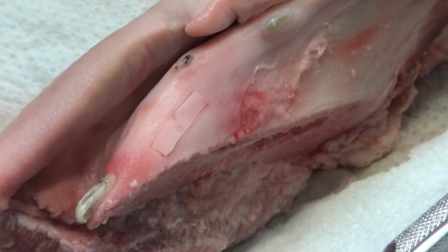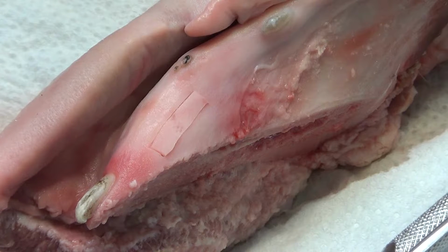The most important thing is to try to maintain the same thickness from the coronal part to the apical part. When you start this final incision, will you start from this and then go deeper, or will you go already 4 millimeters? I do like this. I start mesially with imagine half of the blade I need, and I go distally.